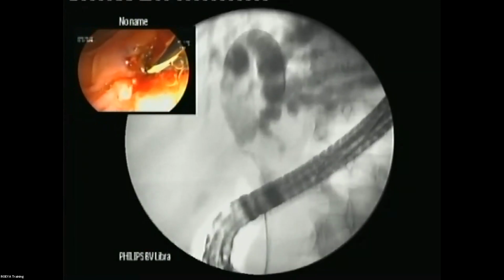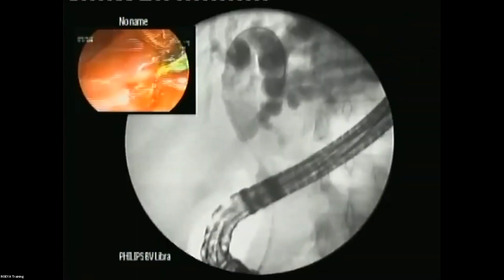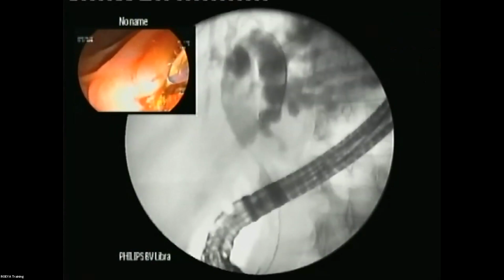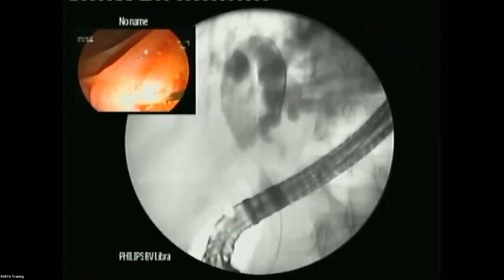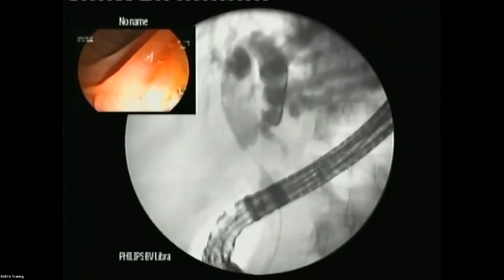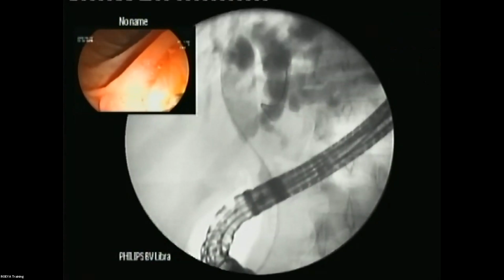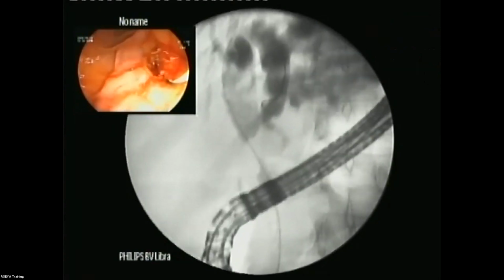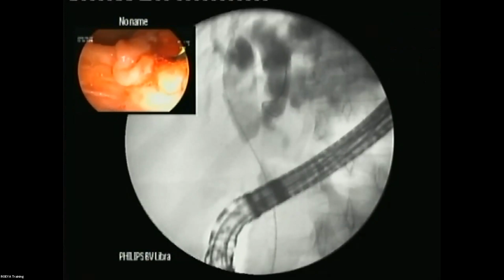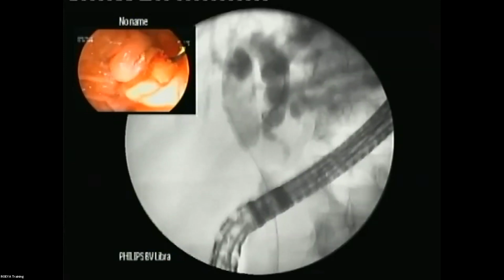But what do you start with? You start by ERCP first. Personally, I will start by ERCP, because if the radiology has to drain both ducts, this patient has to have 2 external drains, one from the right segment and one from the epigastrium. So I think even now, by putting a metallic stent in the left system, we have saved the patient from having an external drain from the epigastrium, which is not really a very good quality of life. Still, the plan is tomorrow to do a right segment PTD, and even a rendezvous. Okay.